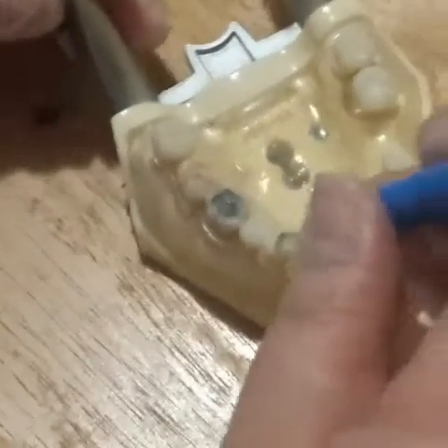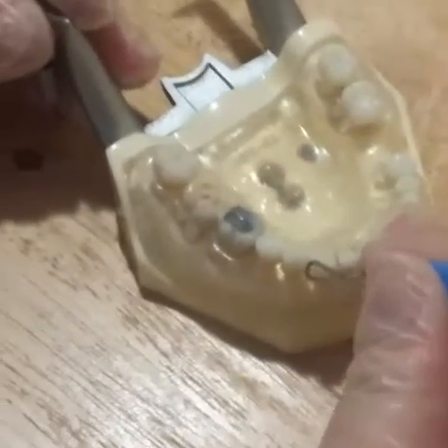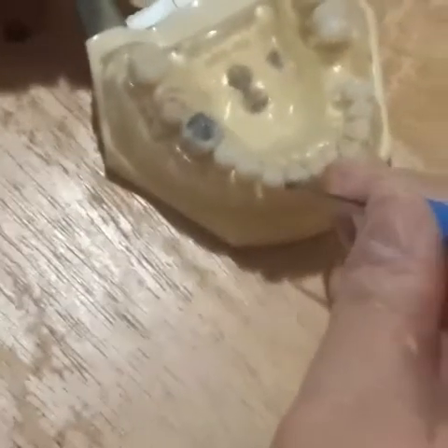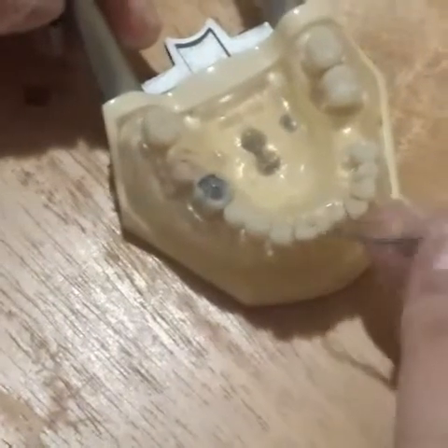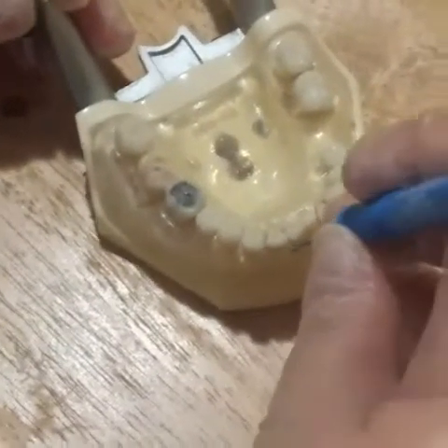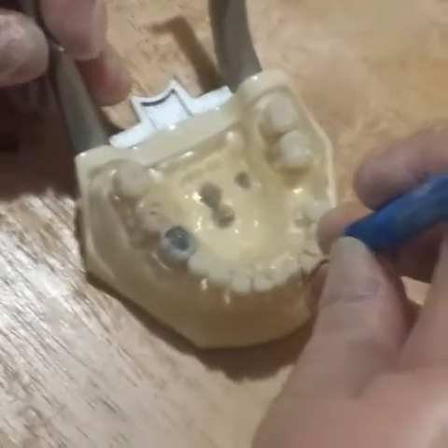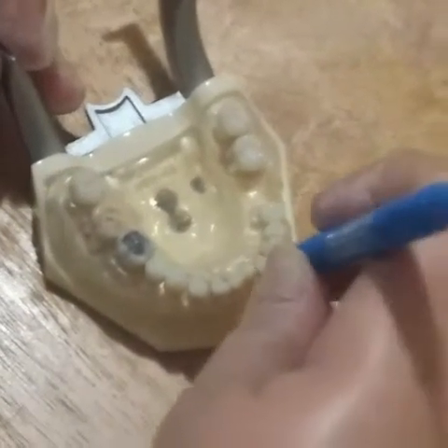When you have reached tooth number 27, you will insert the instrument slightly distal to the midline and use the assessment stroke mesially along the facial surface until you reach the mesial proximal surface. Again, be sure to extend your stroke slightly lingual to the direct mesial surface. Continue this pattern, instrumenting the remaining surfaces through tooth number 22.